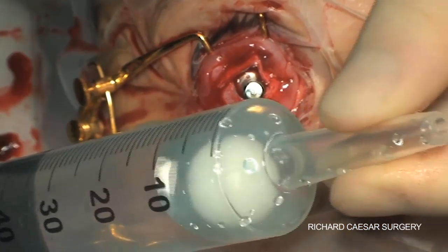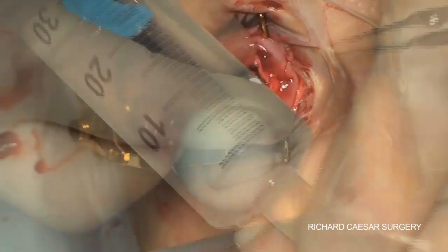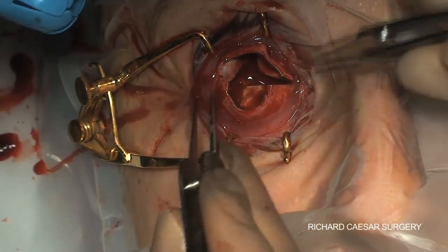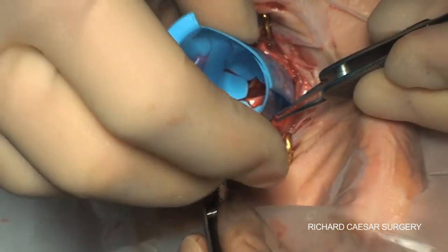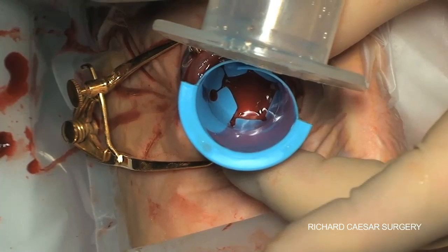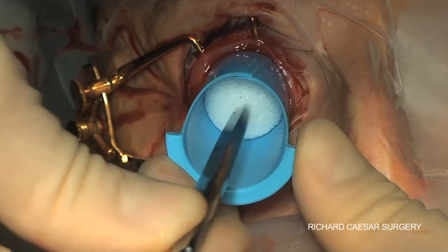This is a Medpor implant and I'm ejecting any residual air bubbles in it and mixing it in a solution of saline with some gentamicin to further minimise the risk of any infection. The Medpor implant comes with an absolutely fantastic inserter, but there is an argument that for an evisceration all you need is a spacer and you don't need an integrated implant, and that the Medpor is therefore a little expensive. However, it certainly is a very nice implant to use, and in a young patient there may well be an advantage for the longevity of an integrated implant.